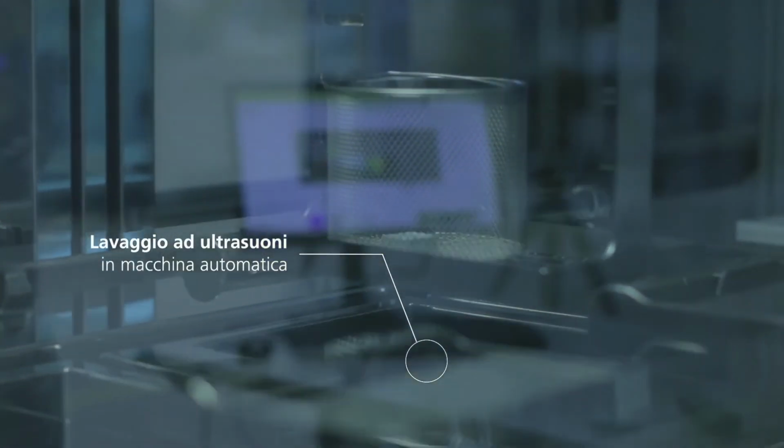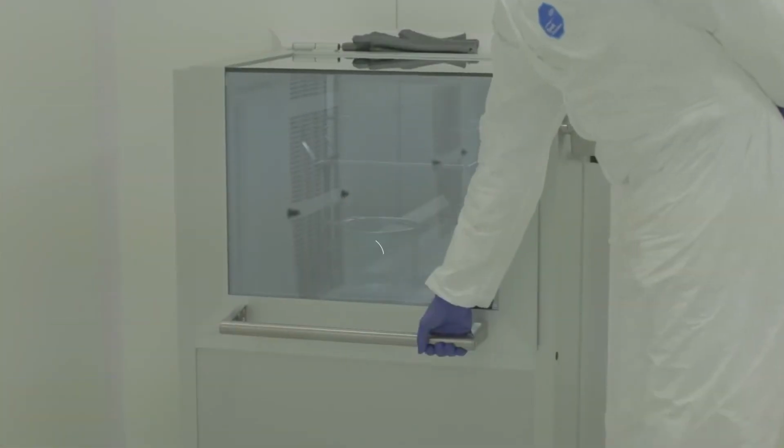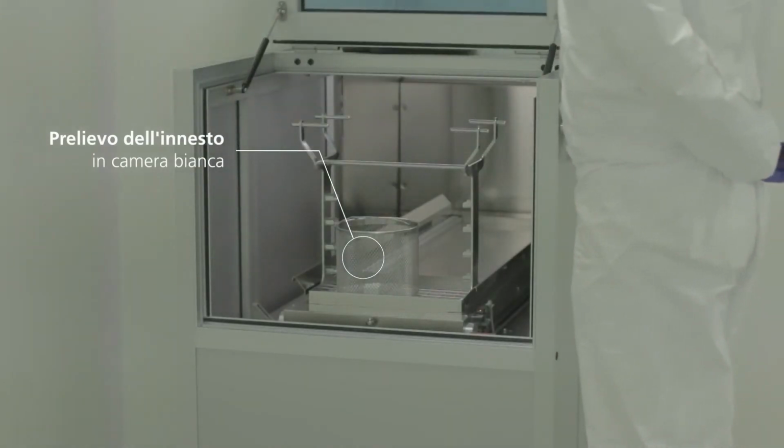We can see the different phases of preparation of the scaffold before the sterilization, and then the packaging, and then the scaffold is sent to the dentist. Straightforward, this protocol goes to the surgery, goes to the intervention. So this is very important.